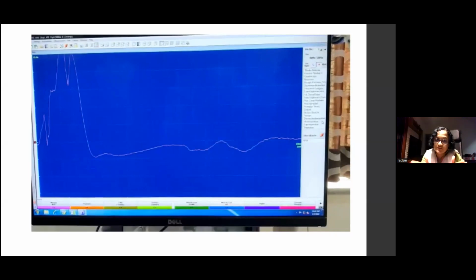So what you saw me do at the last bit, the first one was at 50 milliseconds per division. So we had squashed it to 50 milliseconds per division, so you could see that in full glory, that typical MD1 kind of myotonic discharge. But then towards the end, I wanted to look at the voluntary activity, the motor unit action potentials, and I can't look at that at 50 milliseconds per division, because we are trained to look at it at 10 milliseconds per division.